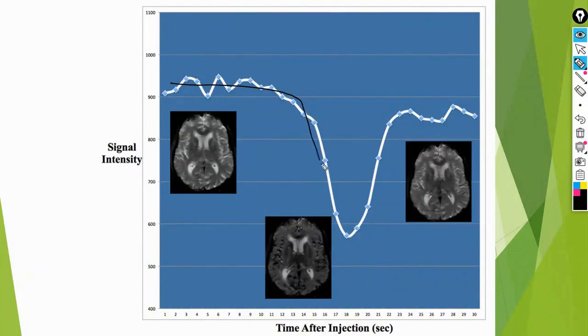After that, what will happen to the signal? Will it come back up? Great, because there will still be contrast agent present. The contrast agent in MRI lasts for a long time. Now the question is, can I study the hemodynamics of any organ or tissue I want using perfusion imaging, or can I not?